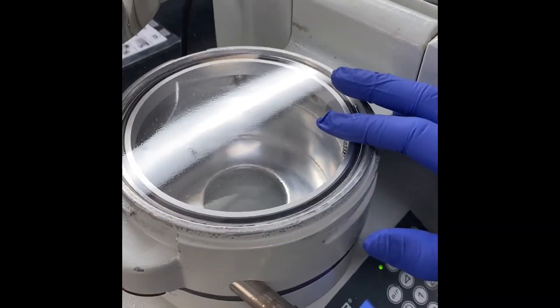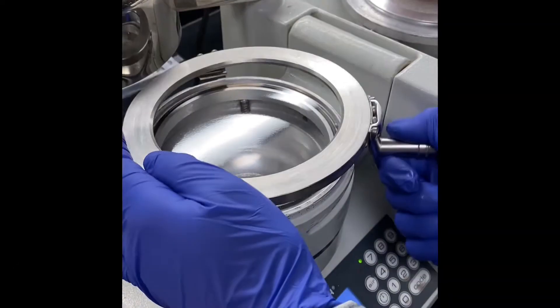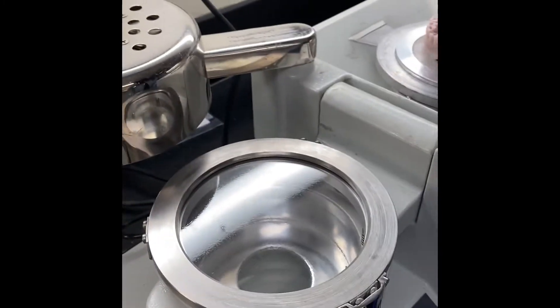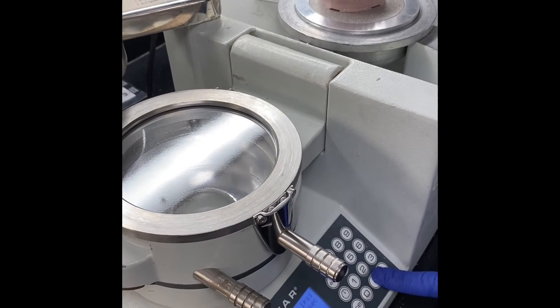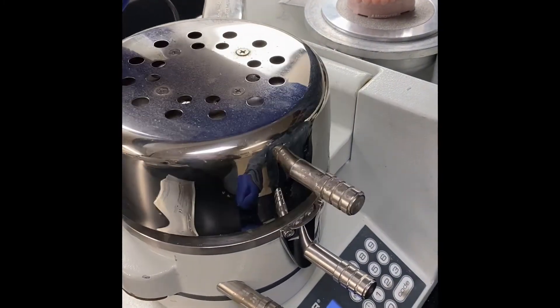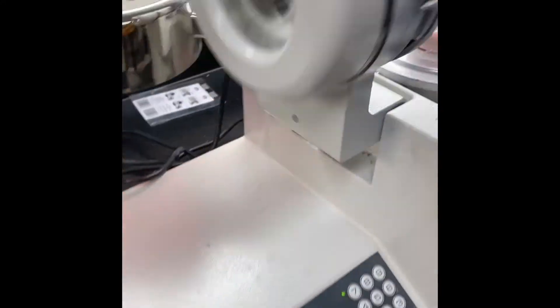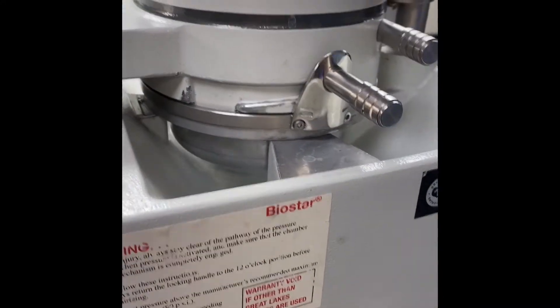The doctors will choose what material is best for your retainer. We will then place the material in our Biostar, lock it into place, and heat it. After 45 seconds, the material is soft enough to be placed on the model, and using suction the retainer is formed.